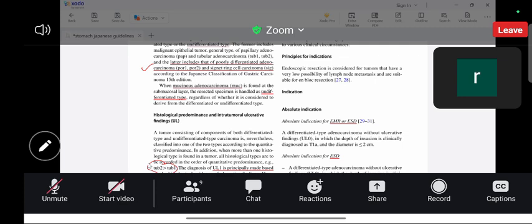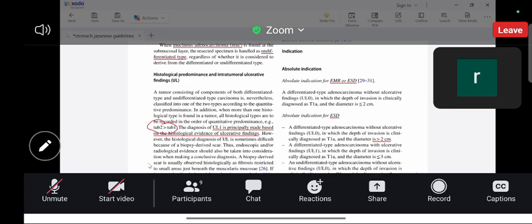And diagnosis of ulcerative lesion 1 is principally made based on the histological evidence of ulcerative findings. And if biopsy was taken previously, we can confuse it with the ulceration because there will be fibrosis. So it becomes hard sometimes to differentiate whether this fibrosis is due to the disease-related ulcer or biopsy-related scar.